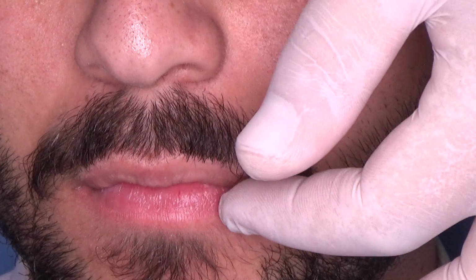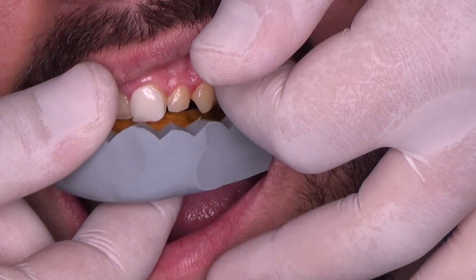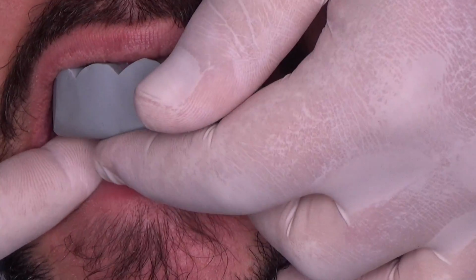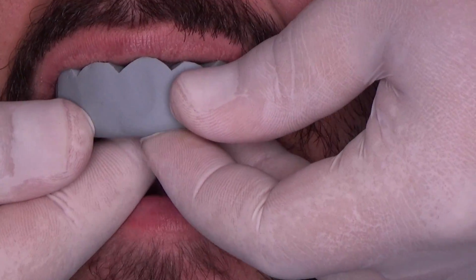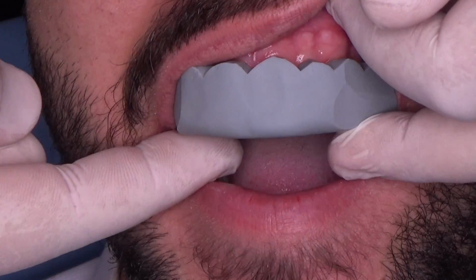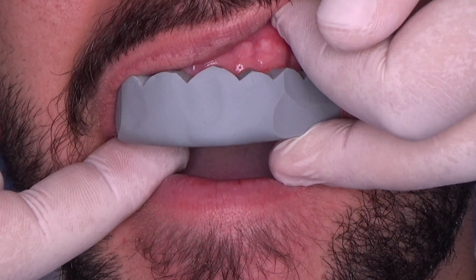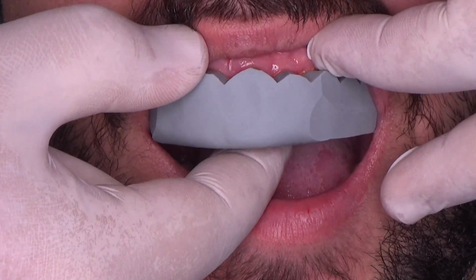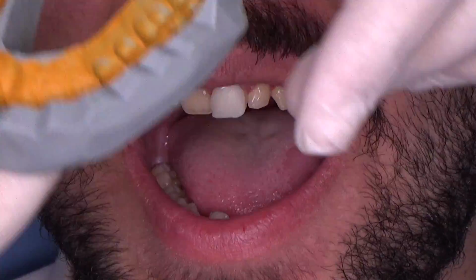Let me check the mock-up, the silicone. The key should stay stable without any movements. That's why we make it on the whole. You keep the old mock-up or you remove? Or now only try? I will remove it now. It is in the mouth. Of course, I will remove it now. Okay.